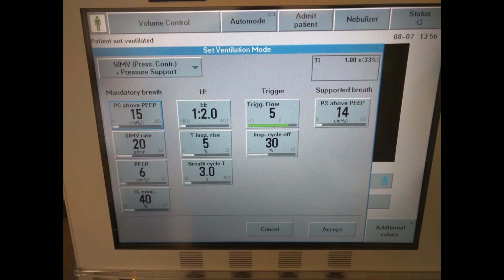The first would be in small patients, generally less than 2 kilos, where the very small tidal volumes you set can make the ventilation a little bit inaccurate because you tend to ventilate the baby and the circuit. And actually sometimes these babies ventilate better on a pressure mode than a volume mode due to the small tidal volumes that you're setting. The other circumstance is where there's a significant leak around the endotracheal tube, which can make using a volume mode of ventilation inaccurate.